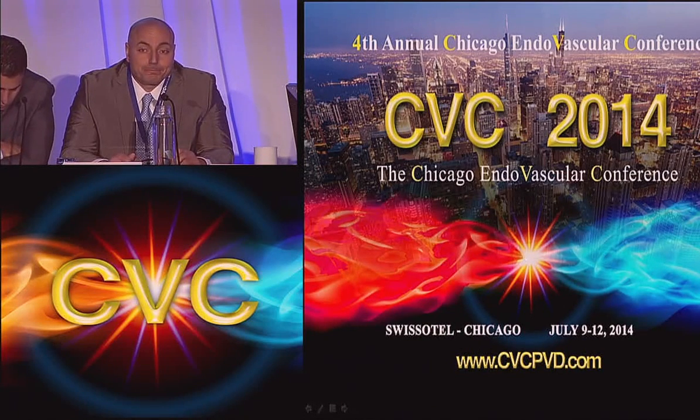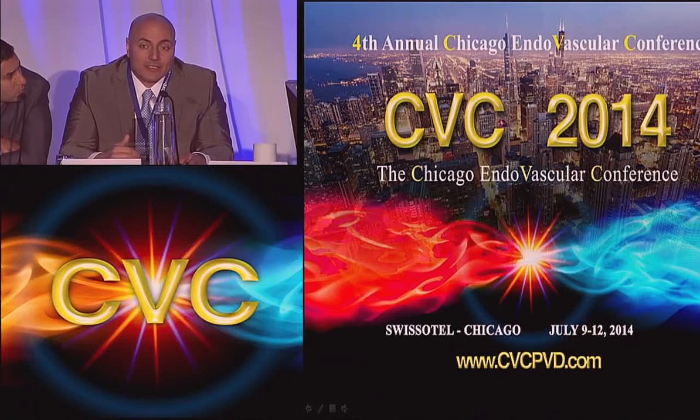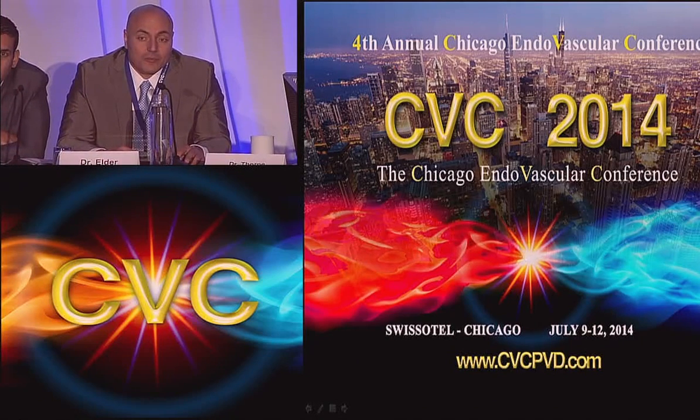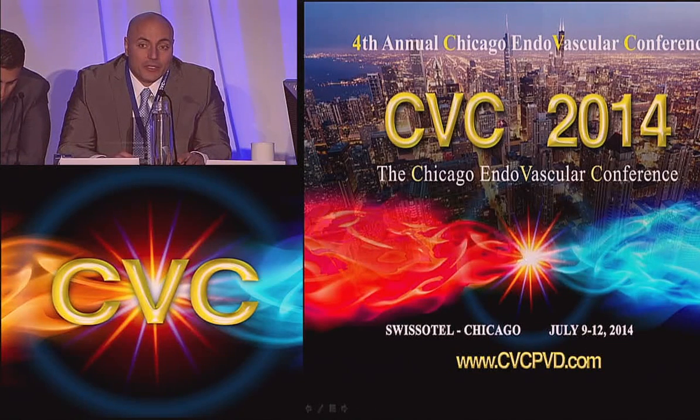Okay. I was thinking, would you just go for the AngioVac rather than going for the ECOS in this situation? The AngioVac is a little bit more complex. There's a lot of setup to it. And so in a very acute, unstable patient, it's not something that you could do ad hoc. It requires a perfusionist. There are 2 to 3 operators that need to come with you, and the access is a little extensive. So it's not a procedure you would use for someone who's unstable, hemodynamically crashing. You'd have to use other measures that you can quickly get in there.